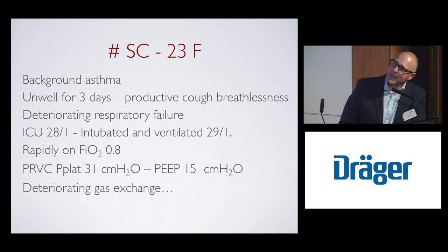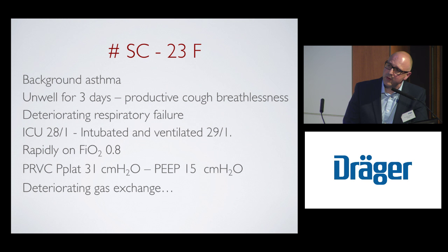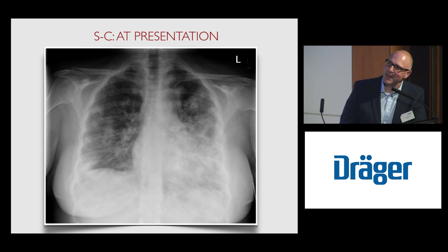So I think this is the lady that I presented in the first talk. This is a 23-year-old with asthma, unwell for 3 days, intubated, and then rapidly on 100%, well, 80% oxygen, and has got a plateau of 31 over 15 and deteriorating. Do you remember that chest x-ray? It hasn't changed. And that's what it is on basically day one post-intubation.